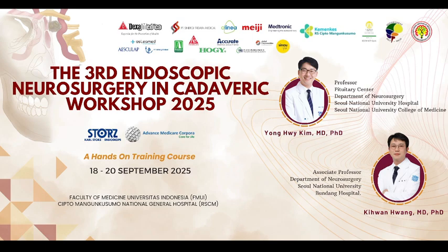Before the surgery, it is necessary to perform a detailed CT scan of the osteomeatal unit. This allows us to evaluate the size of the nasal cavity, identify any septal deviations and pinpoint the location of the ostium. We also use this to understand the pneumatization of the sphenoid sinuses, including its relationship with the internal carotid and optic canal.